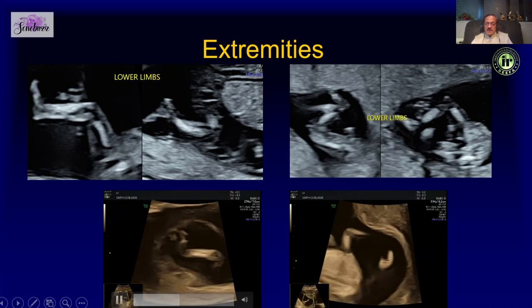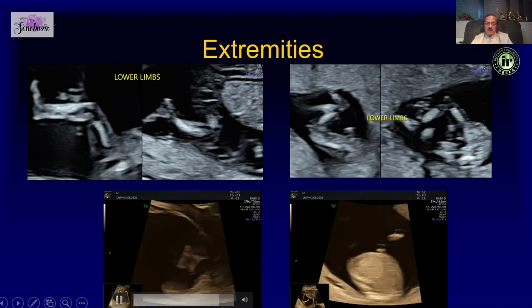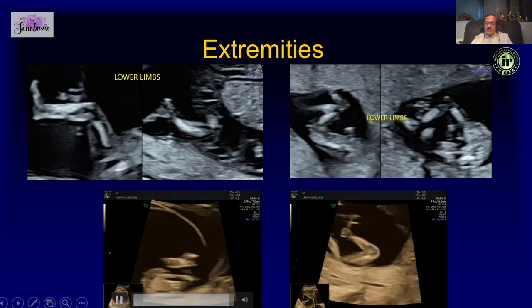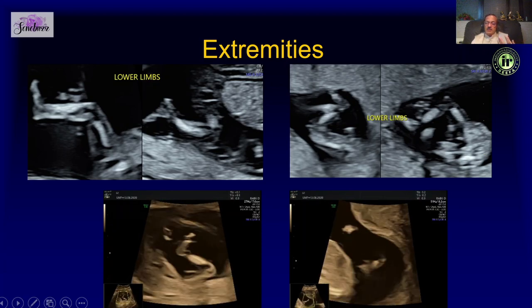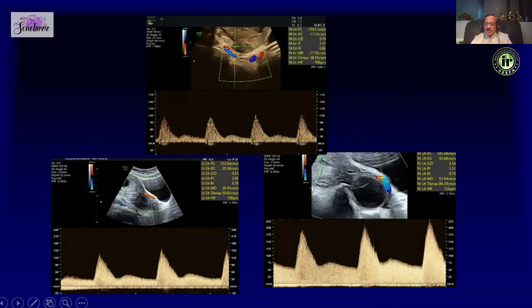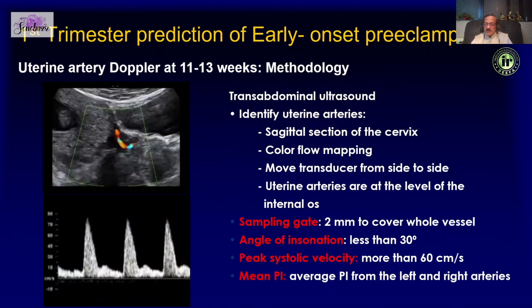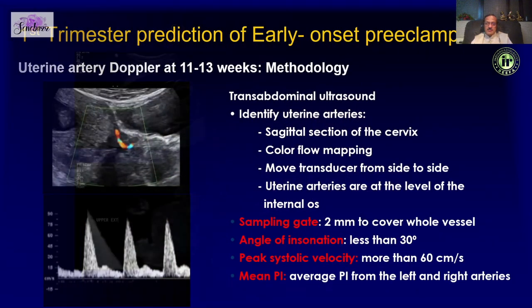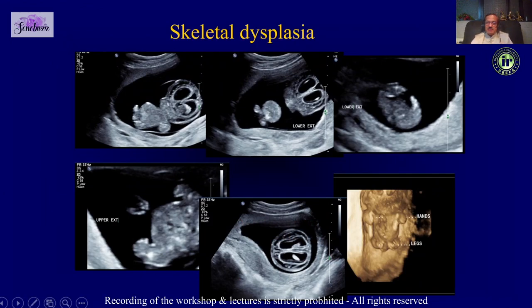You can also look at the lower extremities, make sure the three segments are present, and that the angle between the tibia, fibula, and foot is correct. Fetuses with reduced movements or skeletal dysplasia can be picked up at this early stage — here is an example of skeletal dysplasia picked up in the first trimester.